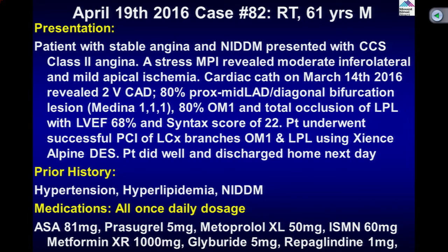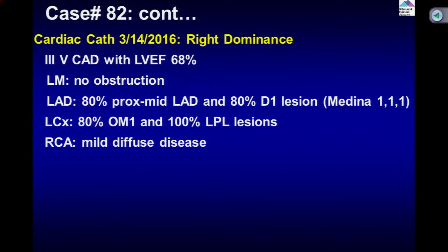Today's case is a 61-year-old male with stable angina and non-insulin-dependent diabetes, presenting with class 2 angina. He had a stress MPI showing both inferolateral and mild apical changes. Cardiac catheterization revealed two-vessel disease of the LAD-diagonal bifurcation, which we will show today, and he had a circumflex lesion which was intervened, with a syntax score of 22 and good LV function. Good medical therapy with more than two anti-ischemic agents. Let's show the angiogram.